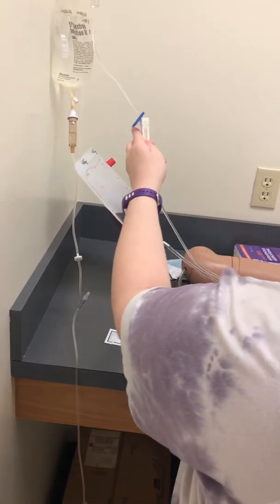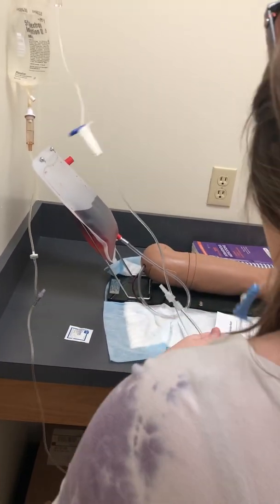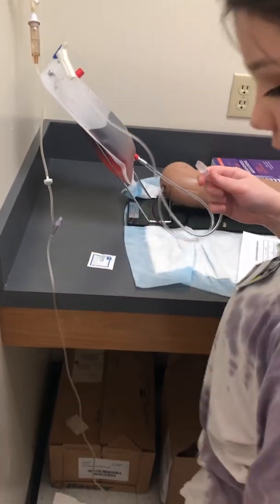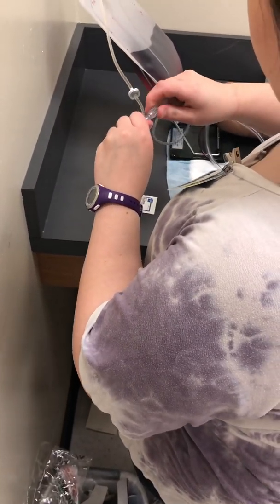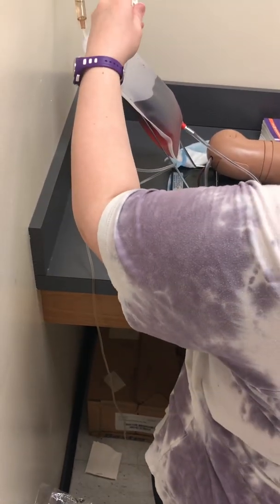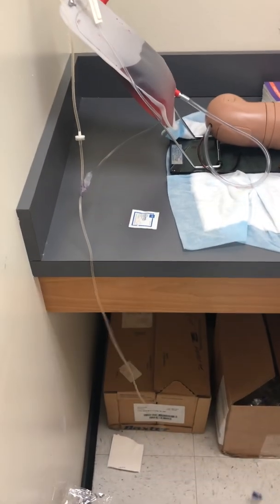Make sure it's clamped off. Make sure this is clamped off. Okay. Unscrew that. Okay. I'm going to open this all the way up, and I'm going to control it with my primary.